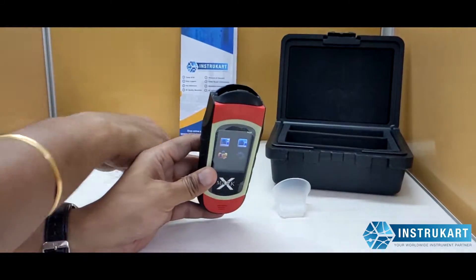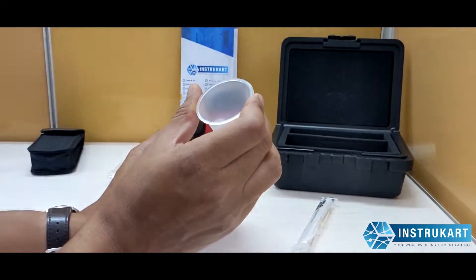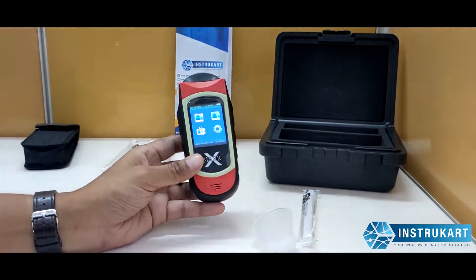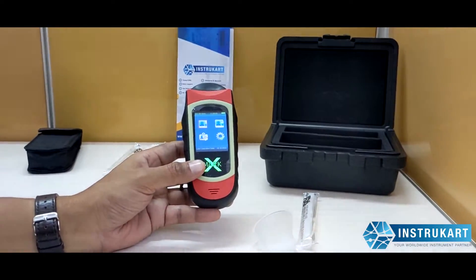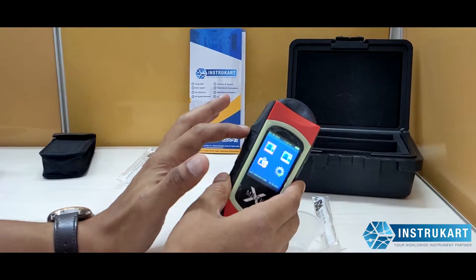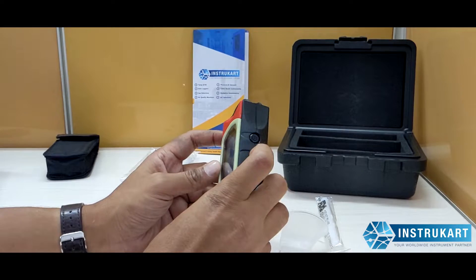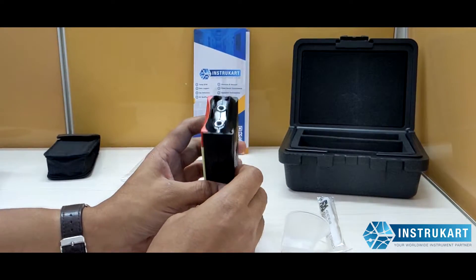The measuring mode supports both active and passive options, meaning you can use the tube or blow directly without it. It also has a real-time clock, and the connection port is USB. As you can see, there are two buttons on the side to toggle between menu options and a power button on the top.